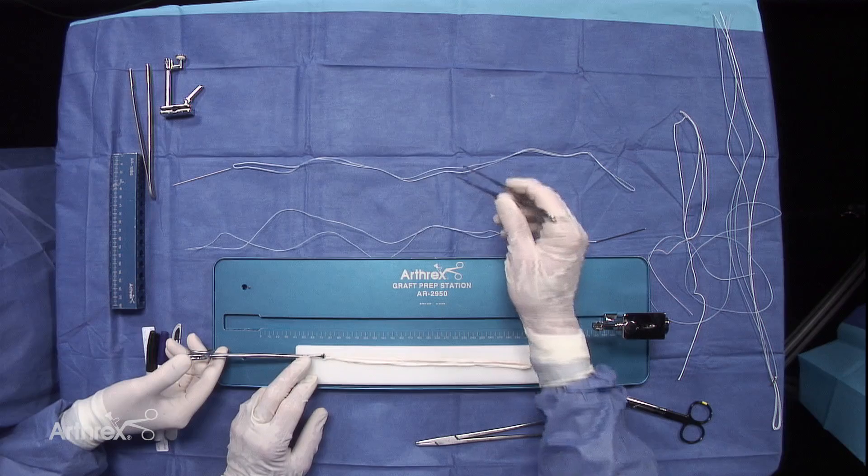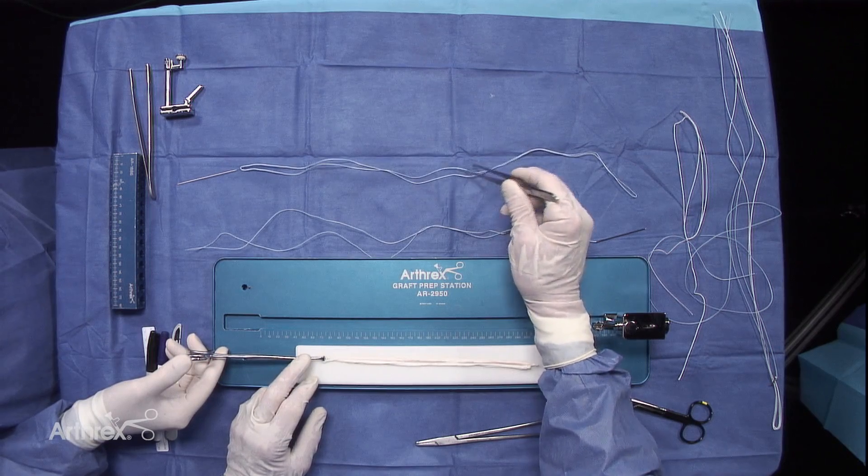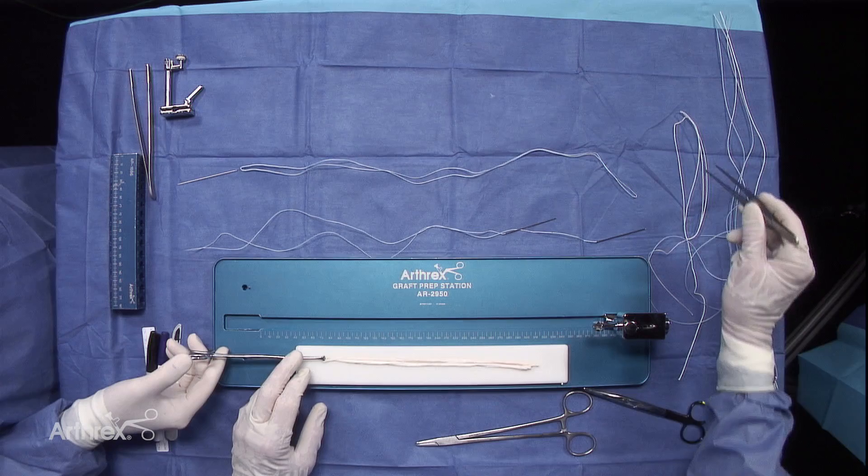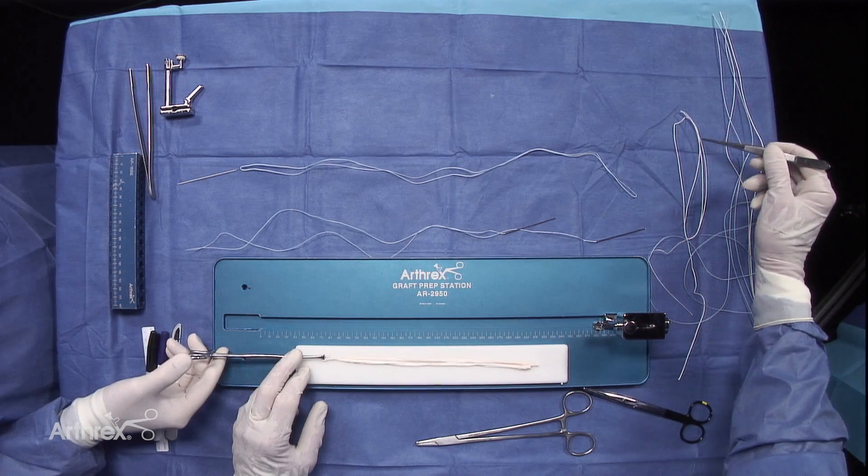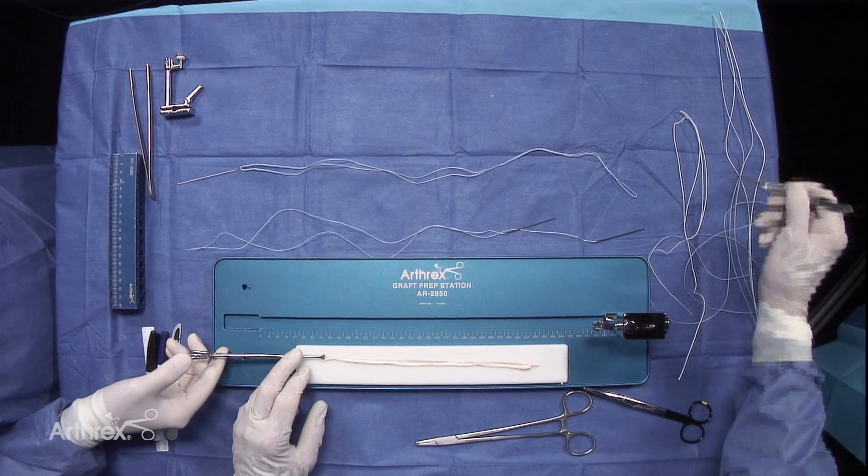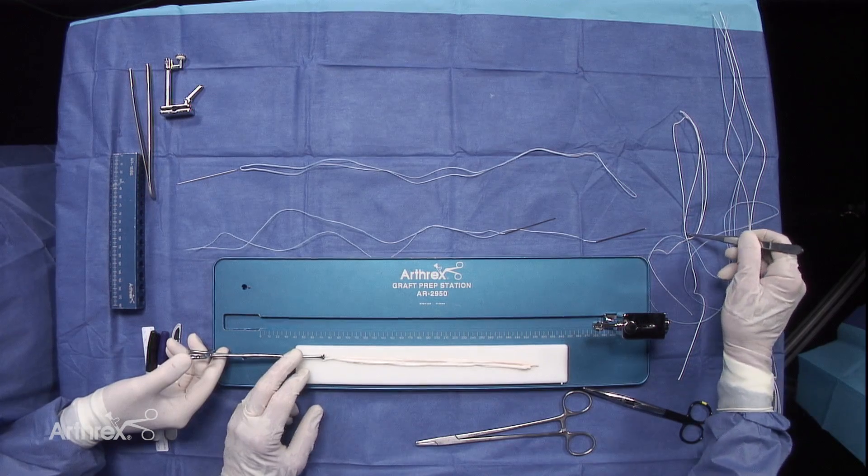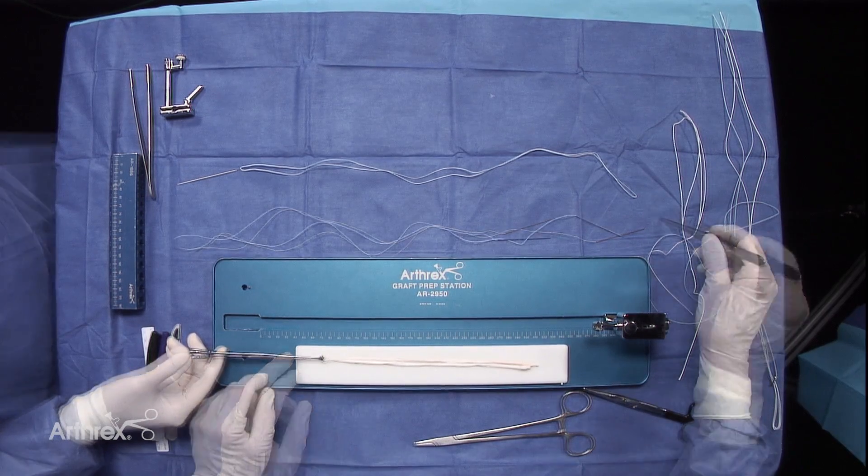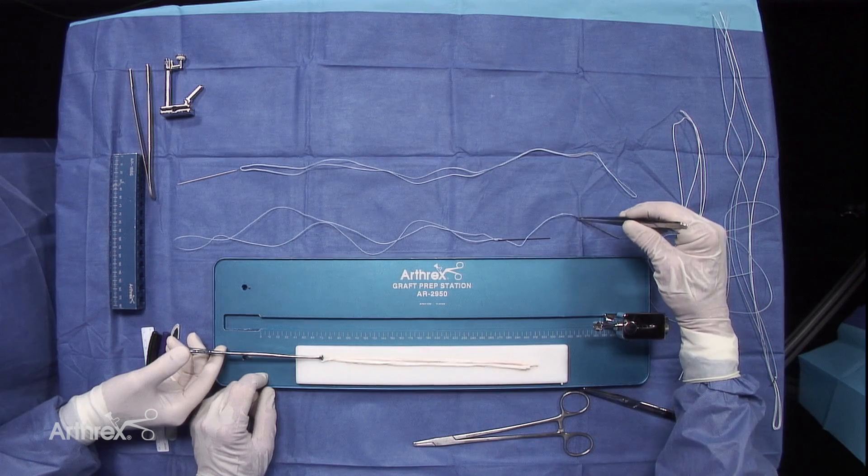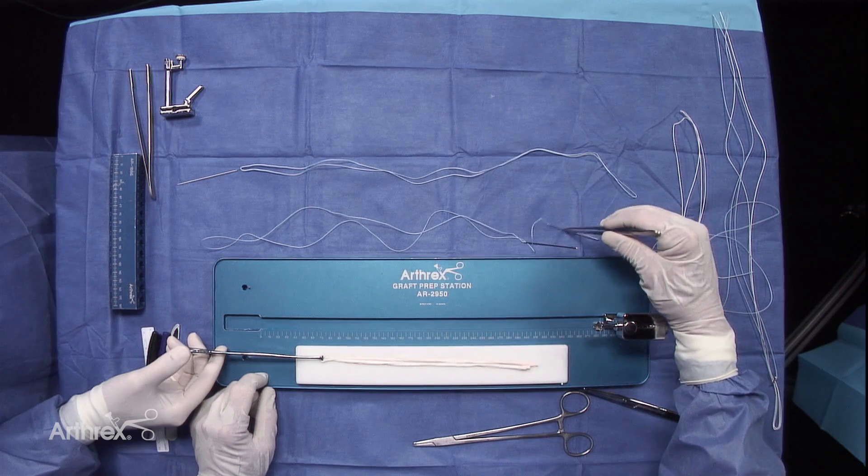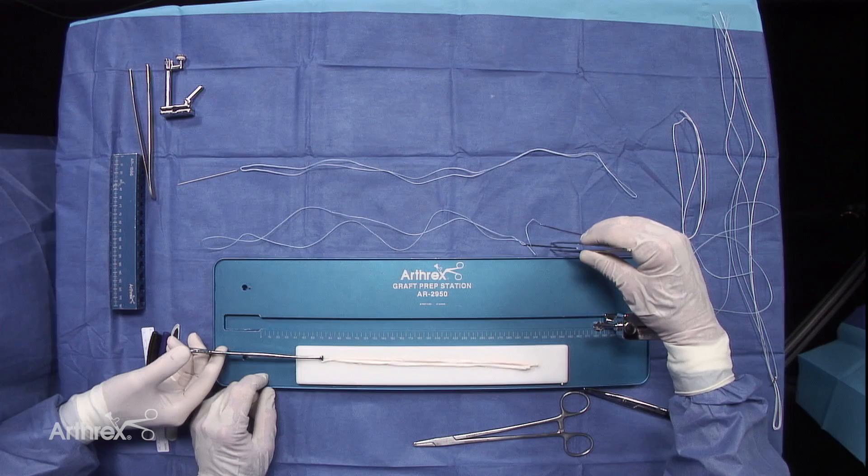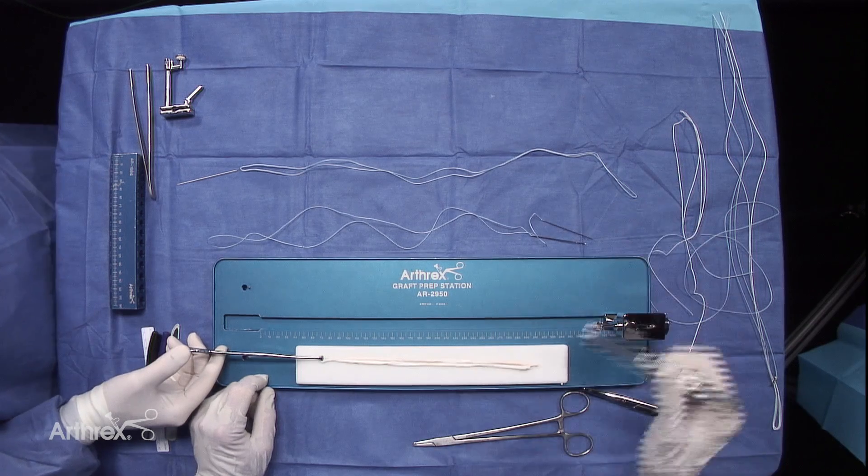To accomplish this, we're going to use the fiber loop, and we have the tightrope, which is going to be on the femoral side. We have the tightrope with the button, the ABS system, which is going to be on the tibia, and then we have a number two fiber wire with two independent needles, which is very important in the final construct of making this 6-strand graft.